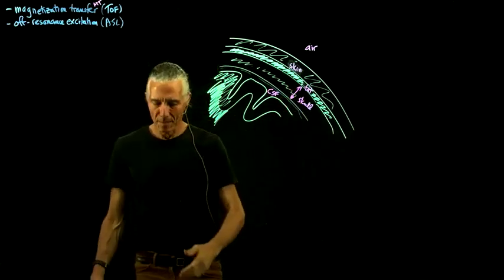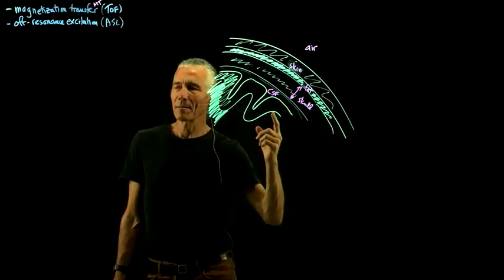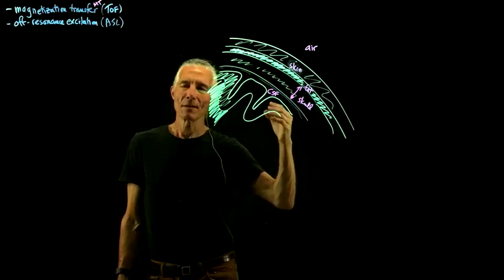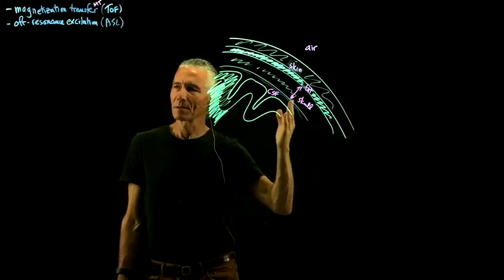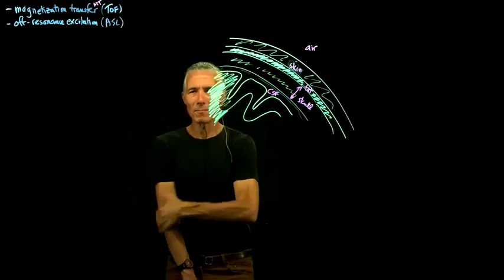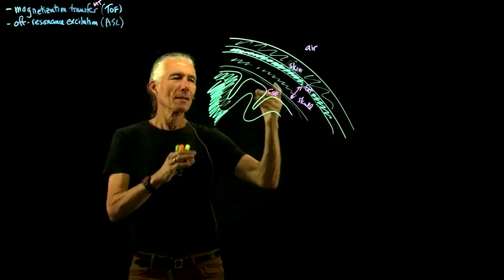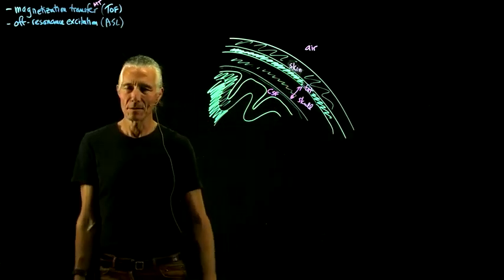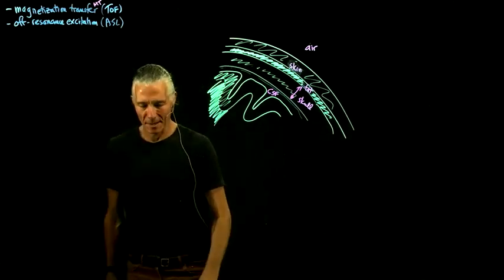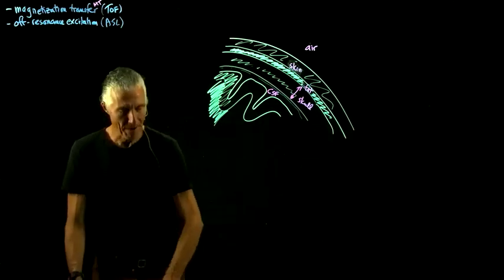CSF, however, is making a big signal, but it will be dark in a T1 scan because it will have taken longer to recover, and so you'll see a different contrast. So that's why you want multiple contrasts, because if you use different kinds of contrast, then you could pull apart some of these things that are the same color. That would be, for instance, the same color in an X-ray. But you can tweak and fiddle with it. So MRI is tremendously flexible that way.